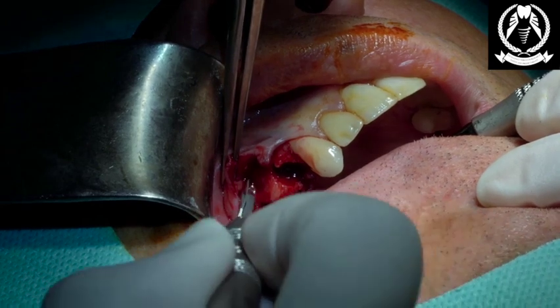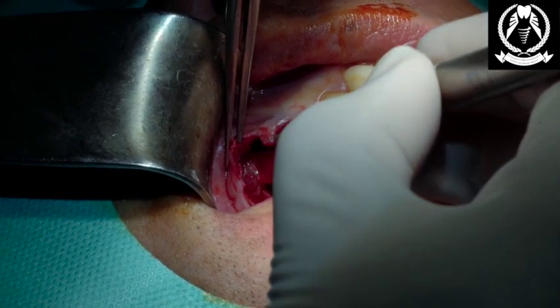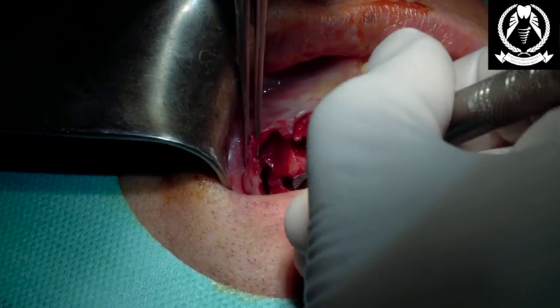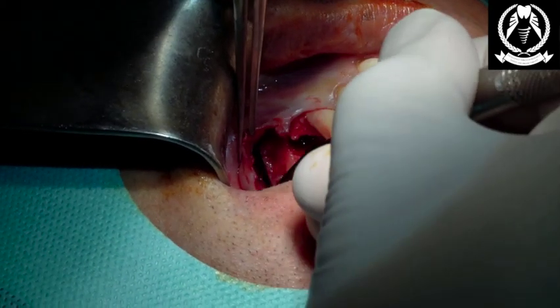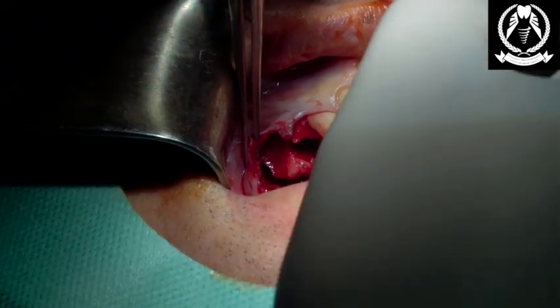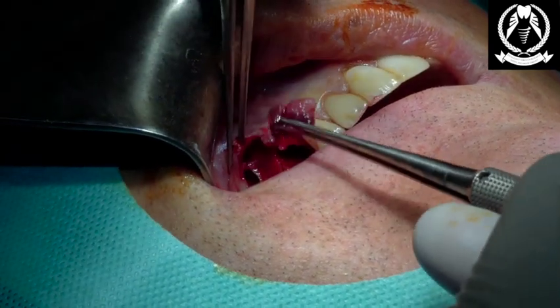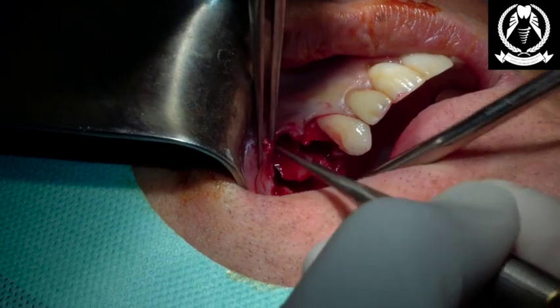And then you can see that granulation tissue emanating from that socket, and we are going to do some enucleation of the cyst using some various periosteal elevators to see the extent of the damage of that infection. So it's really important to remove this infection, especially when we're placing implants. You can see we've got it nicely enucleated in one go, and you can see it's an epithelial lined, probably what is a dentigerous cyst there. Can you see that on the camera? Yeah. And that cyst is all removed now, and we can now really visualize the remaining bone structure as well as the width of the ridge and the socket anatomy.